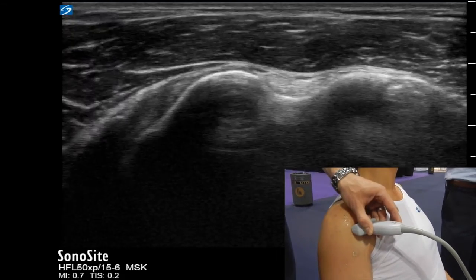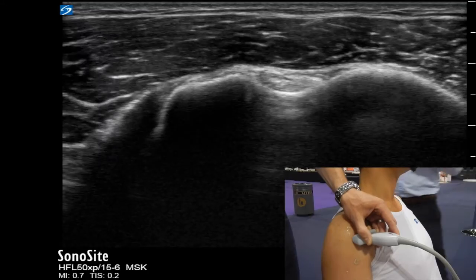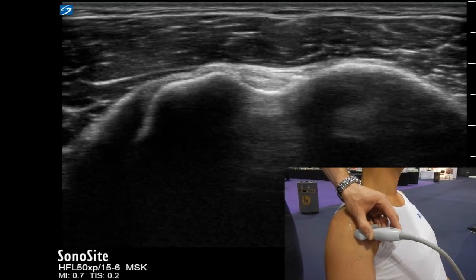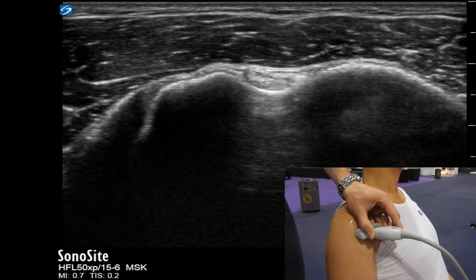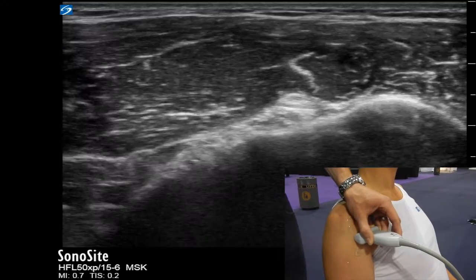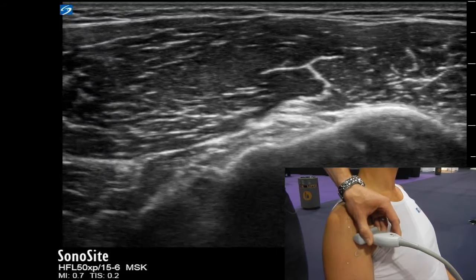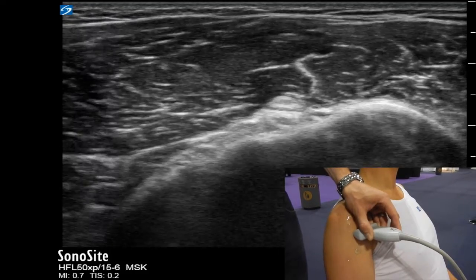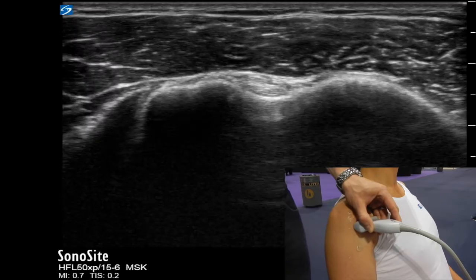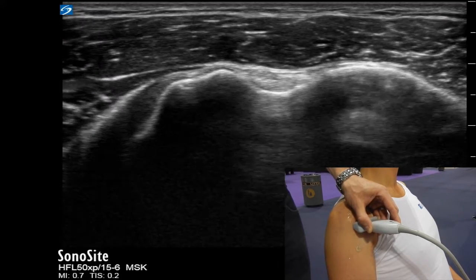It's also an area where you can pick up more information that can play a role in what you'll find later on in your shoulder scan. Looking for long head of biceps effusions can often indicate the presence of a rotator cuff tear further up. It may also indicate a local long head of biceps tenosynovitis, and utilizing Doppler functions on your ultrasound machine will give you more information alongside your clinical examination.